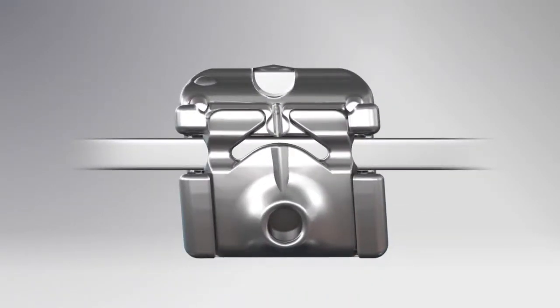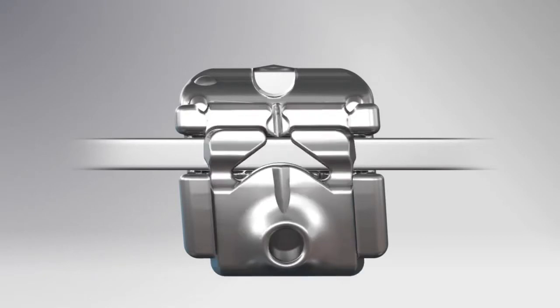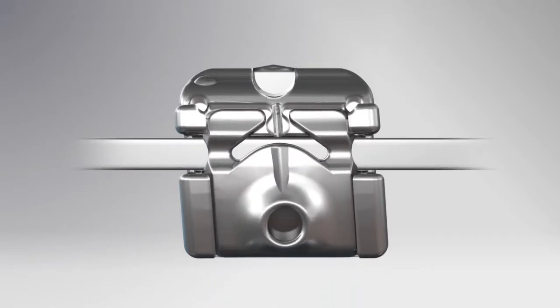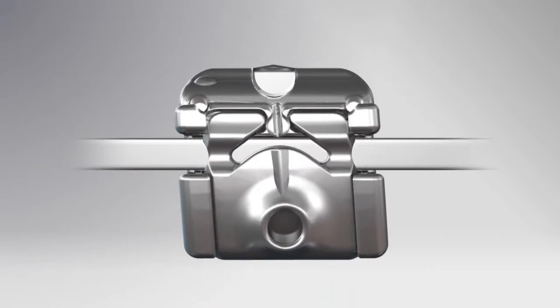To allow for quick and easy archwire changes, the door simply opens using the Carrier instrument, which fits perfectly in the small round indent on the labial side of the bracket, and then, with gentle finger pressure, the door closes.